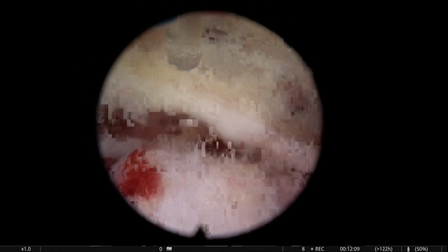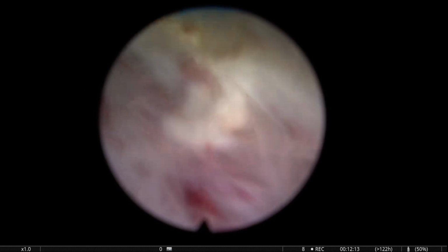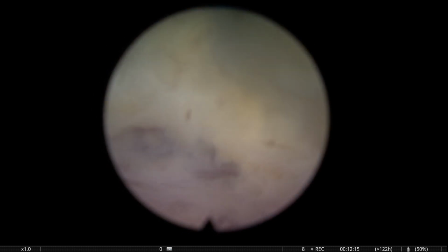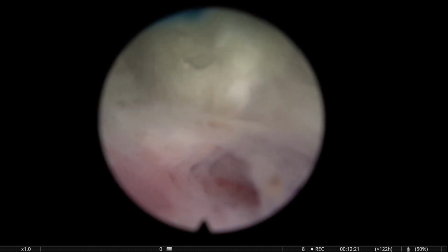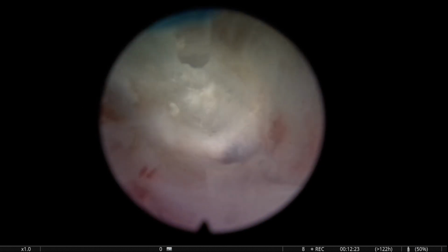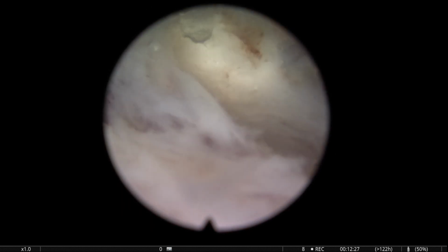That's the deeper anterior line that we were developing. So I'm going to follow that path because, of course, you want to remove the whole adenoma. Sometimes it's very sticky, and it's very interesting, you know, this idea of the plane.